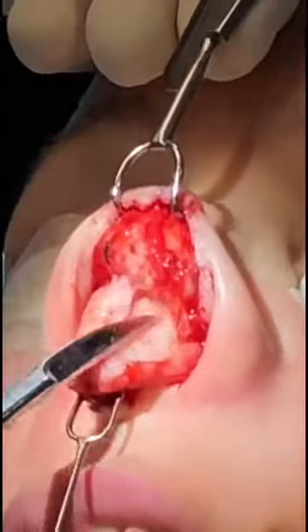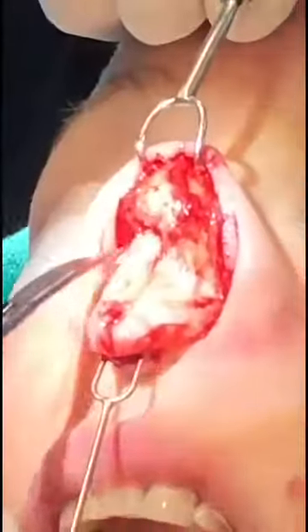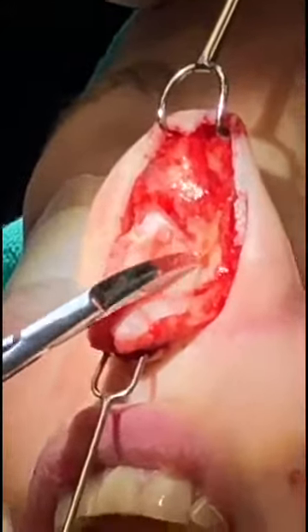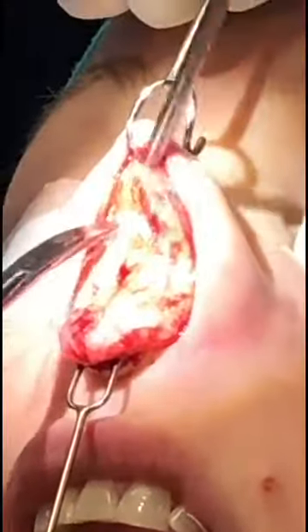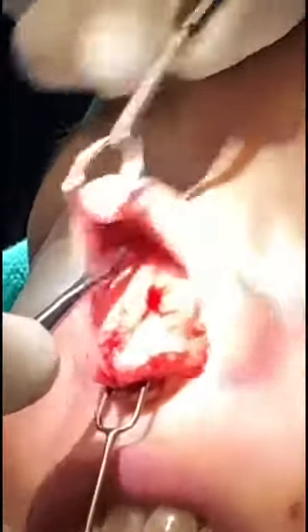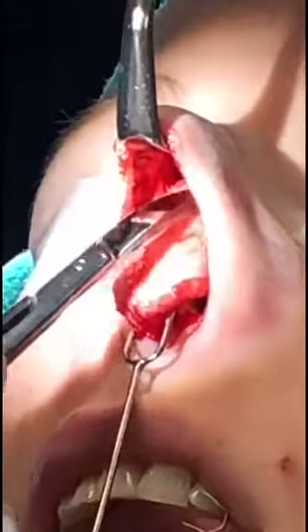You can see the nice white cartilage there. We're continuing to elevate this up. As we move up, we can see we're getting into the bridge of the nose right here. We're going to use a little elevator to elevate the periosteum. That will allow us to file down the bone exactly the way that we want it to be. Let's dissect a little bit more.